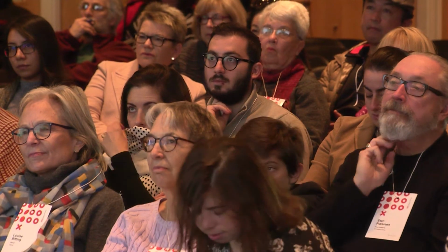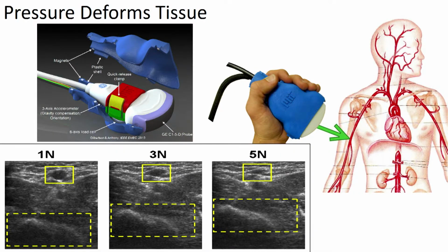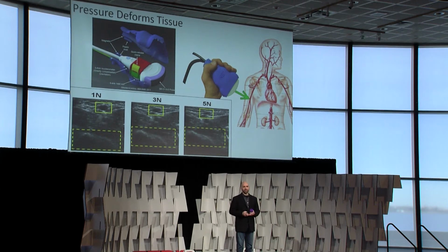So what you're seeing on the screen is an exploration of the act of deforming tissue. So your body, there's bones inside, but most of it's the soft tissue that you deform. And tissue deforms from the blood pumping through it, so internal pressure making the tissue deform. And you can deform your tissue by applying external pressure, by pressing on your body. What you're looking at here is an ultrasound probe, analogous to what you'd find at MGH or Beth Israel Hospital or any hospital around the world.